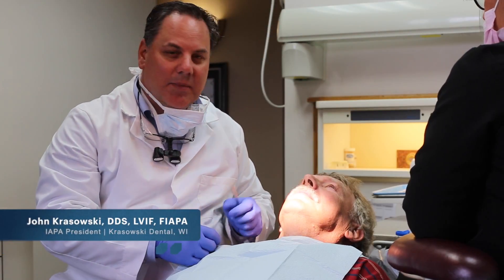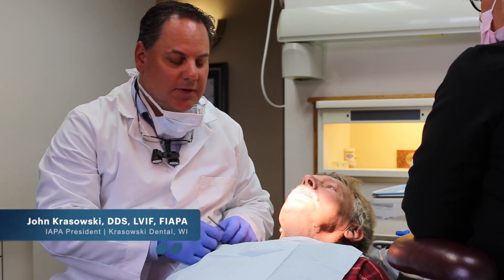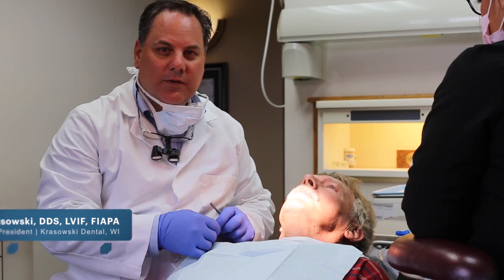Hello, I'm John Krasowski. Today I'm going to be working on Frank. We're going to be doing an infiltration injection with the Nutri system for numbers six and seven.